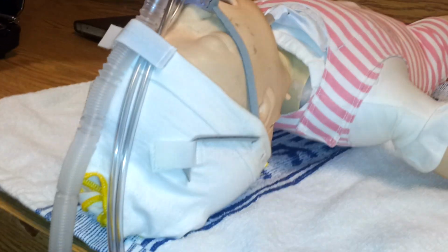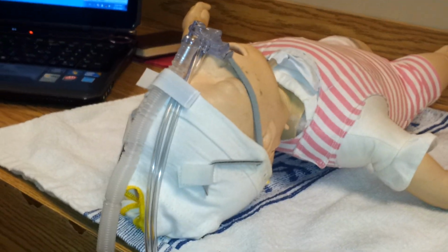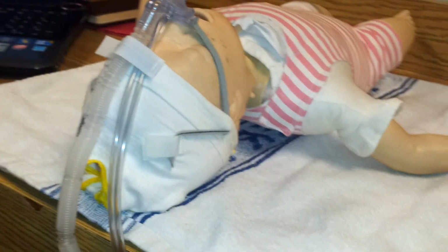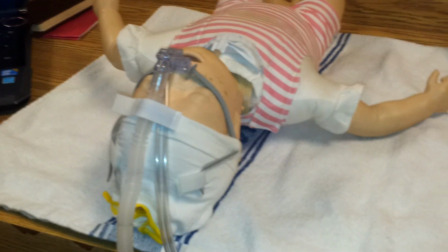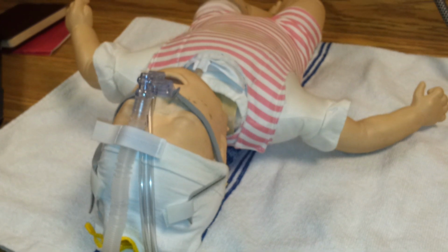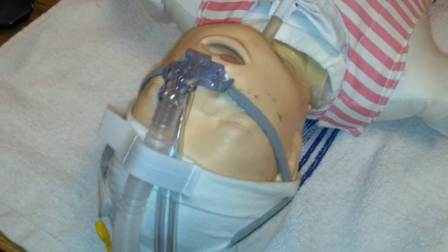So one thing you should always do when hooking up nasal CPAP is you always want to insert an orogastric tube to alleviate any gastric distension. Gastric distension can push up on the diaphragm and limit lung expansion. It can also cause the patient to throw up, possibly causing aspiration pneumonias.